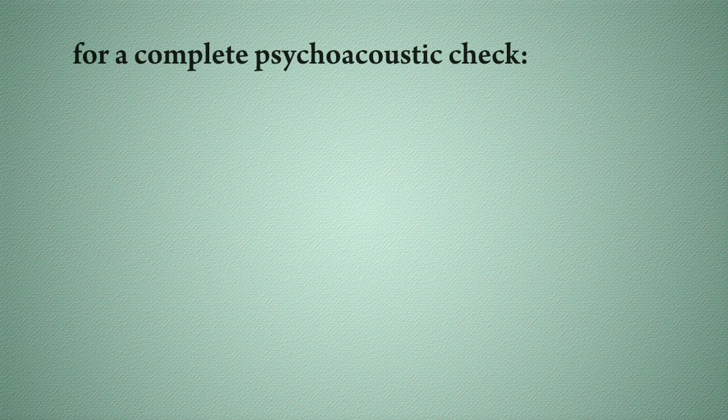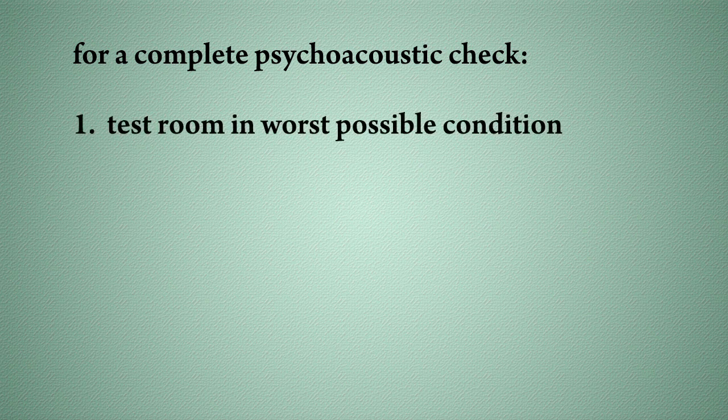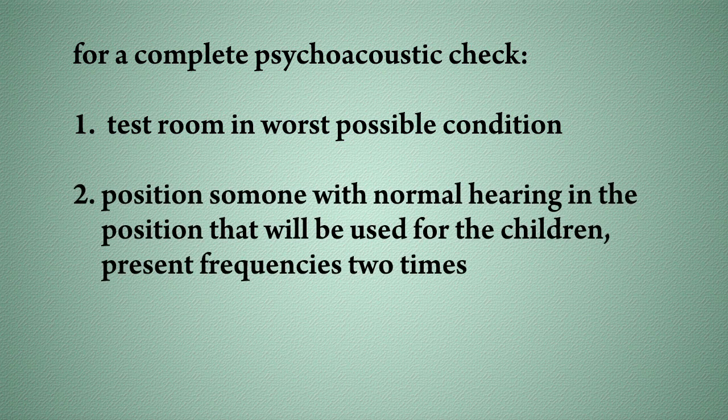For a complete psychoacoustic check, do the following. First, test the room in the worst possible conditions that will be experienced throughout the day. For example, if the air conditioning will be going on and off, do the listening test when it is on. Second, position someone with normal hearing in the position that will be used for the children. Present all frequencies at the screening level 2 times.